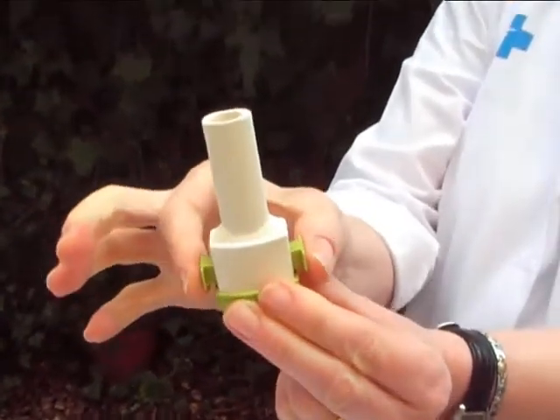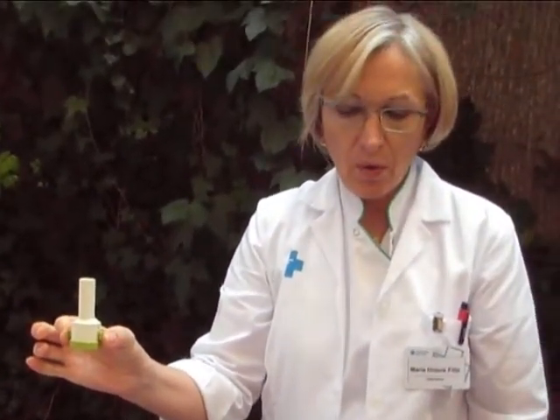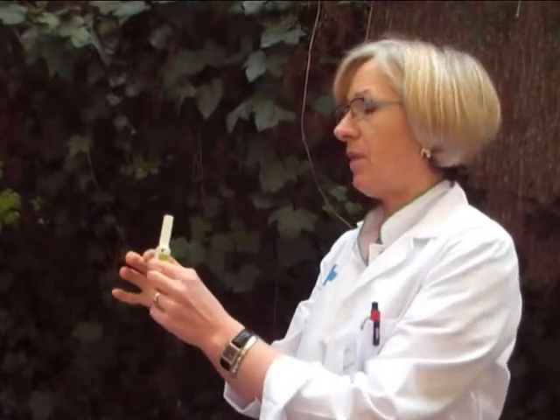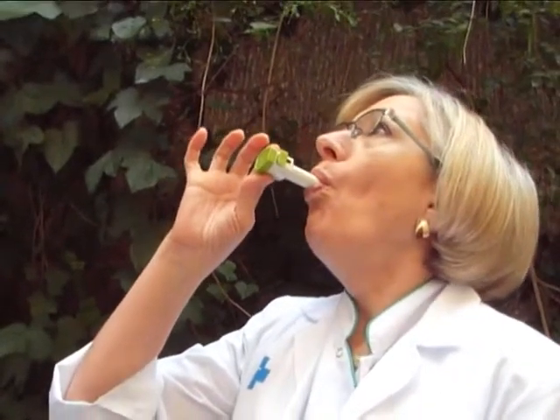Squeeze the side and let go. This will puncture the capsule. Turn away from the inhaler and empty your lungs. Place the mouthpiece between your lips and breathe it through your mouth as deeply, as hard as you can.